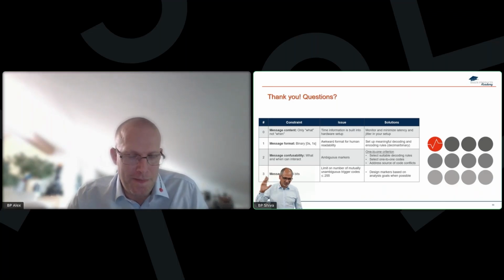So the pulse width, as we talked about earlier, determines whether it can be detected; if it's too short, you will miss it. And this can sometimes be a property of optical triggers, for example, and you may not be able to change it. So one option is to use a pulse stretching device. For example, the trigger box has the option where you can artificially stretch the pulse before it is sent to the amplifier. And maybe Alex, you've written an article about this. Maybe you can say something about this as well.